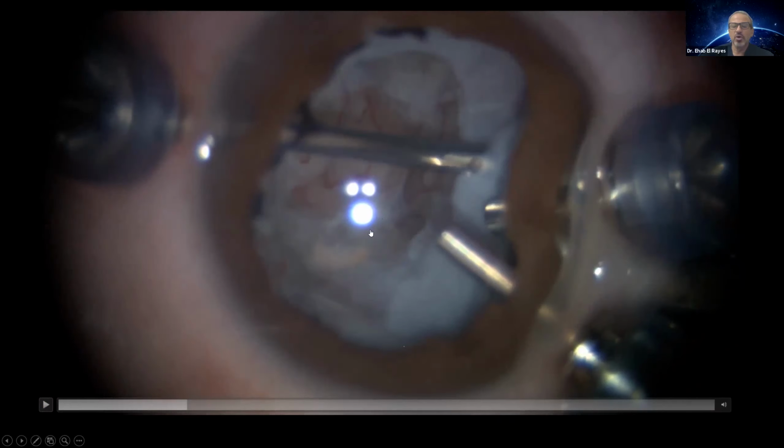There are several vectors inside the eye. One coming from the optic nerve to the retinal periphery or the retinal trough, and this is the pillar. If you have to cut it, you have to cut it first at the trough, then dissect it all the way to the back of the eye to have relaxation of the retina.